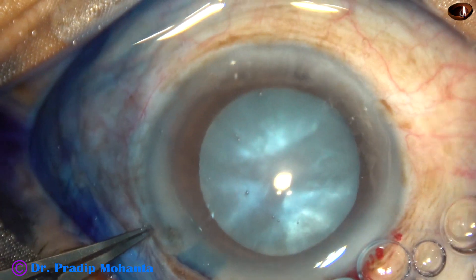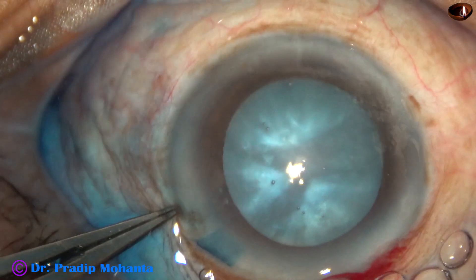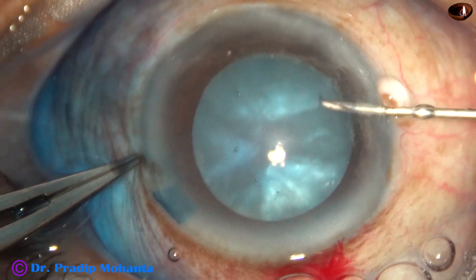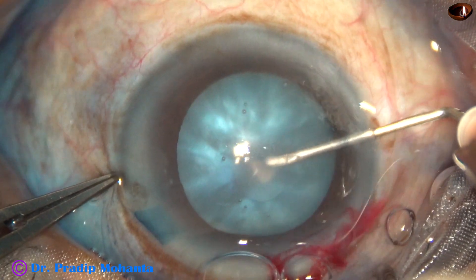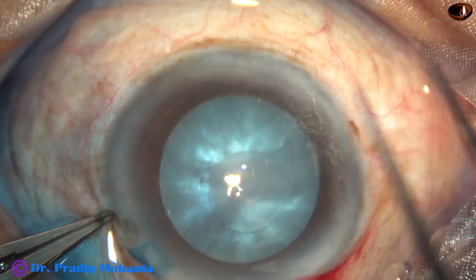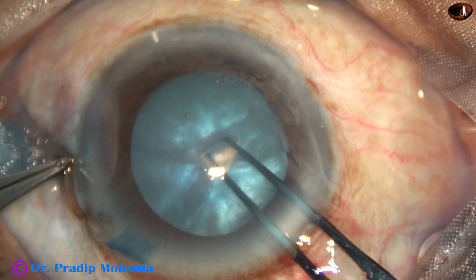One more side port is made on the right side of the main incision. The side ports are about 2 and a half clock hours away from the main incision. Now see the rhexis — the anterior capsule is punctured, and the flap is not straight. The flap or tag is contoured. It's a C flap.